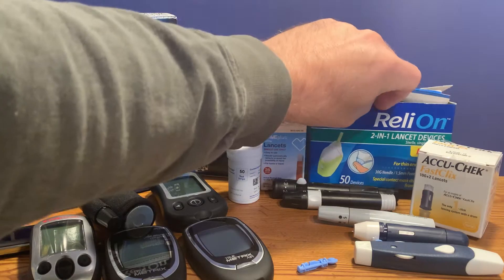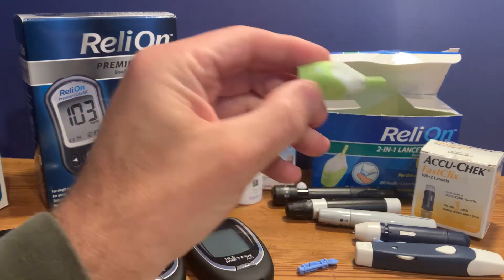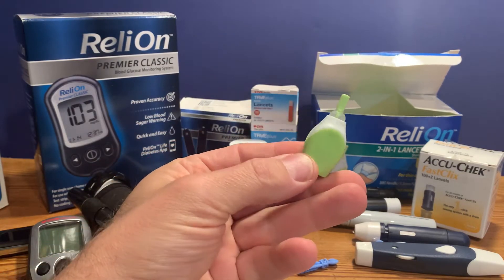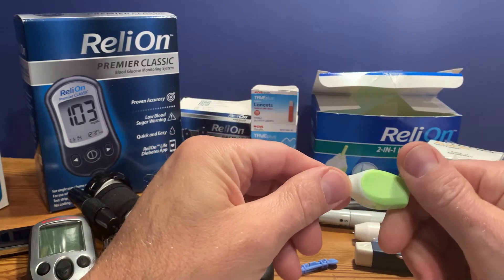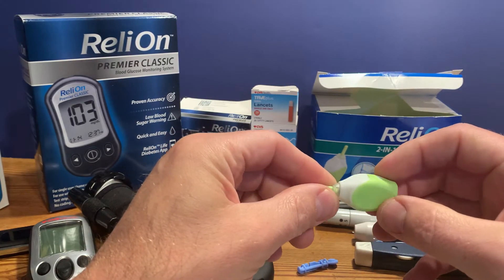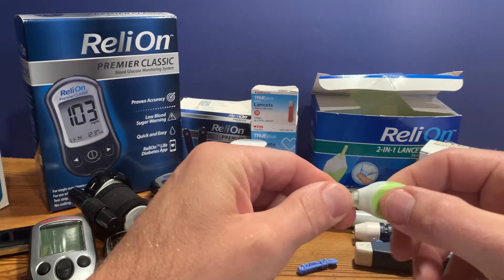There are single-use lancets. This is a single-use from ReliOn — ReliOn is a Walmart brand. This one is nice as it's easy to grip, and these are handy on the go. You can carry them with you if you need to test your blood sugar when you're out.